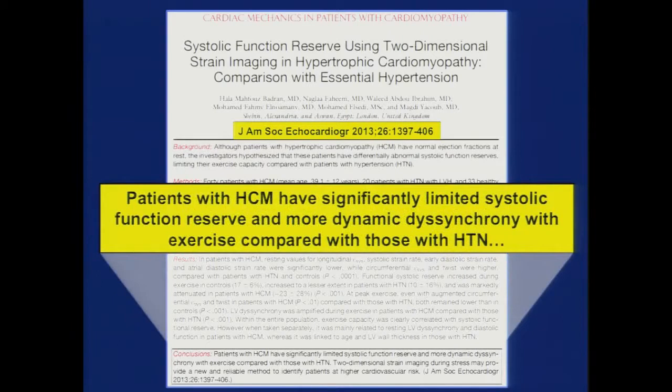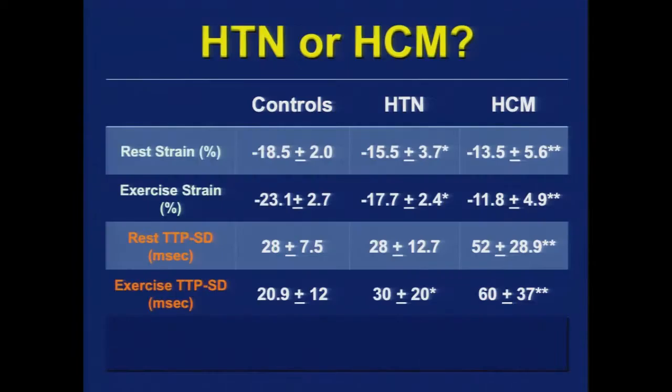those that have hypertension versus those that have hypertrophic cardiomyopathy, because it really harps on the discussion we had a few moments ago. If you look at patients with hypertension or hypertrophic cardiomyopathy versus controls, at rest the longitudinal strain is decreased. The hypertrophs during exercise were not able to augment strain the same way that the hypertensives were. The hypertrophs, not surprisingly, had more of what is defined as dysynchrony because they may have heterogeneity in wall thickness.